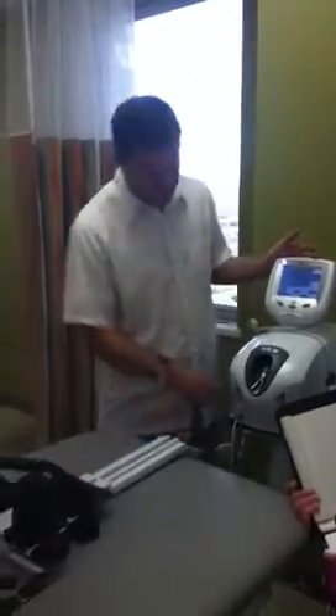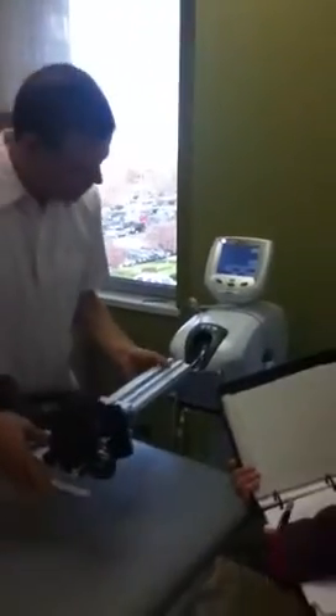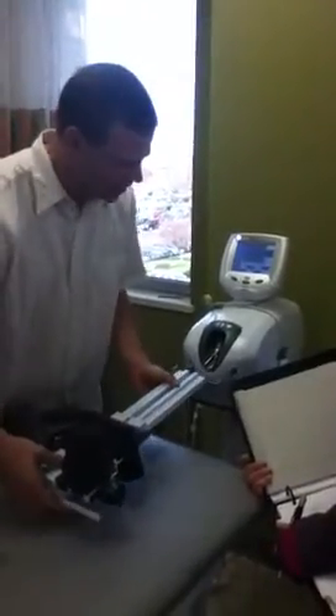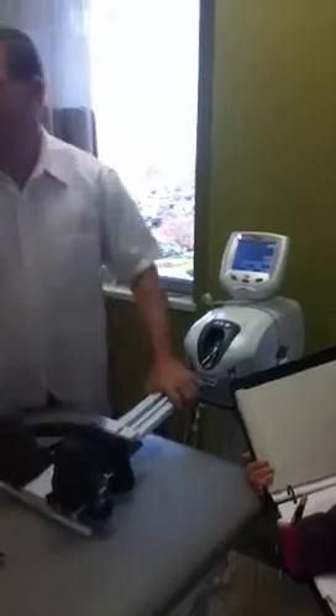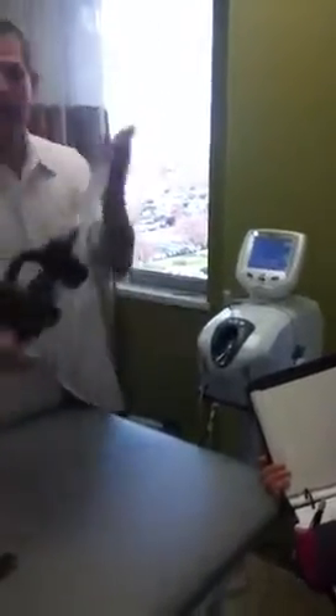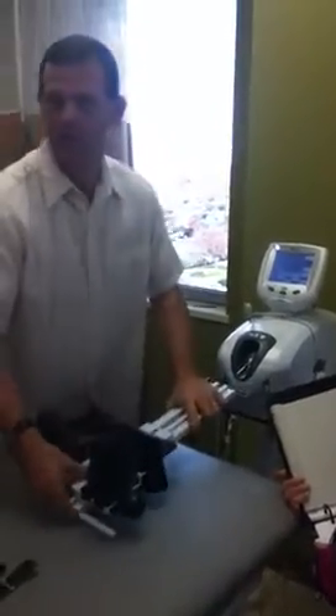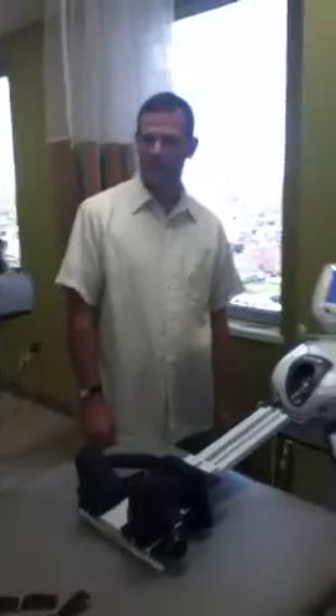Sometimes the harness goes on differently. This harness goes into here, so I've got to pick it up, raise it up, and click it in so that it stays there. To get it out, I've got to push up to release it. Did you hear the click? So now that thing's clicked in.